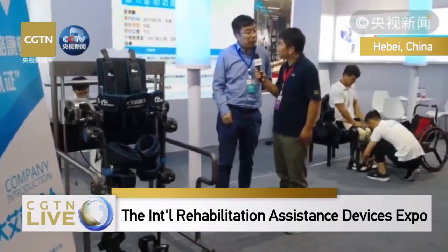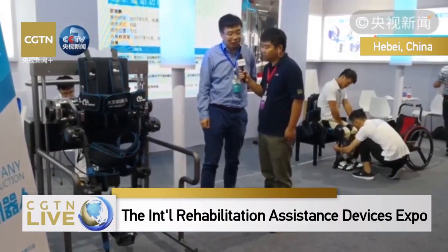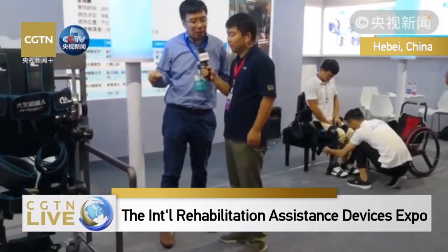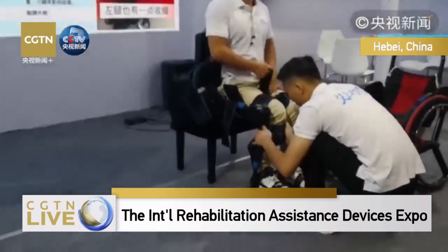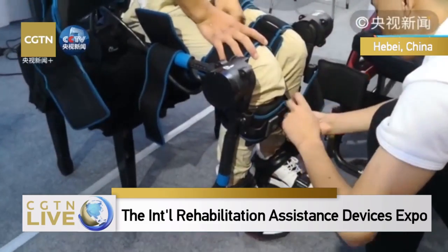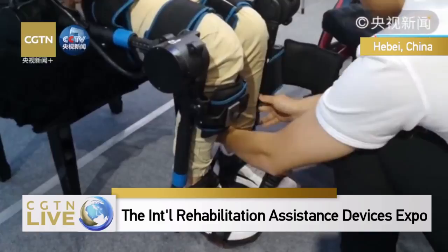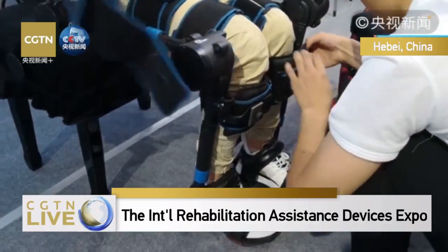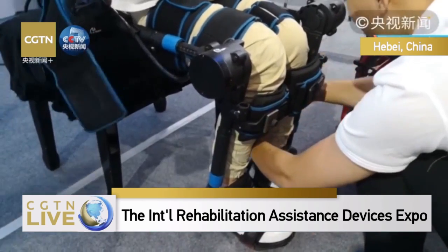And the therapist can help the patient to determine which kind of steps and what kind of power should be applied to this device. It has an internal intelligence system, so everything is under the doctor's direction. The patient cannot decide the parameters and settings on their own.